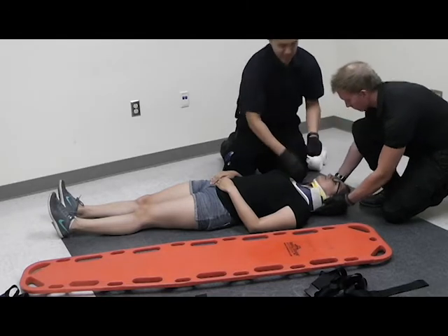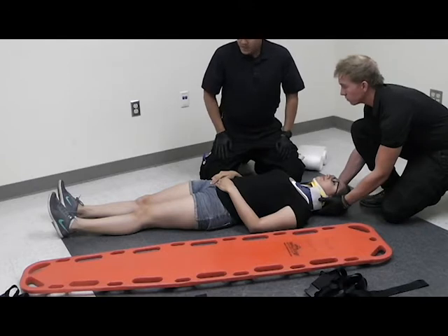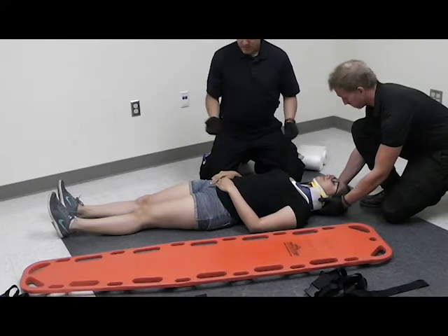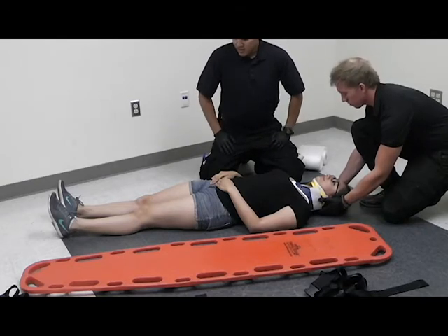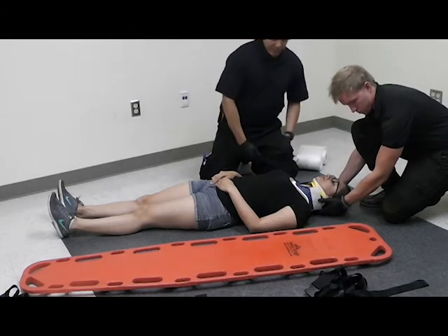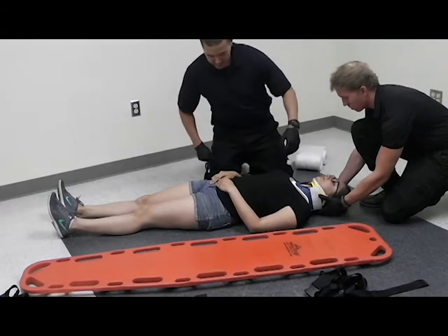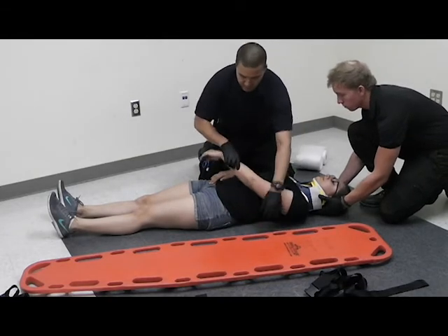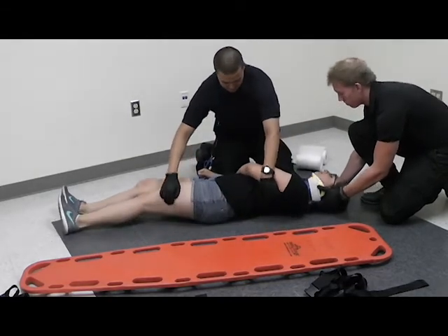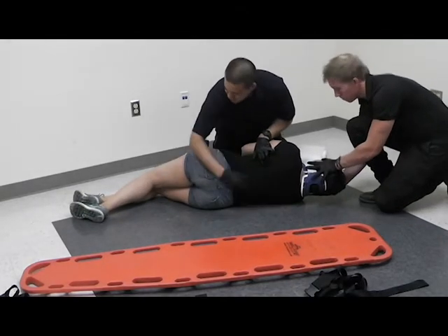During this whole time, my partner will be maintaining manual stabilization. I'm going to do a rapid head-to-toe check for any bleeding or deformities. If there is none, I will continue on. A good acronym to check for bleeding or deformities is DCAP-BTLS. I will then direct my partner to hold manual stabilization while I roll the patient onto her side, then check for any deformities using DCAP-BTLS.